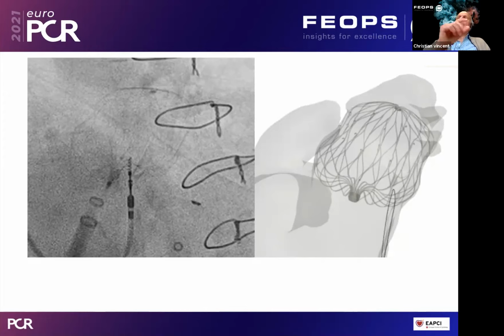I also see a few physicians saying that it will also be applicable for specific cases. According to your experience, when did you see the best benefit of using FEops HEARTguide for the different types of LAA morphologies? Can you give us a bit more ideas about your personal experience on that?